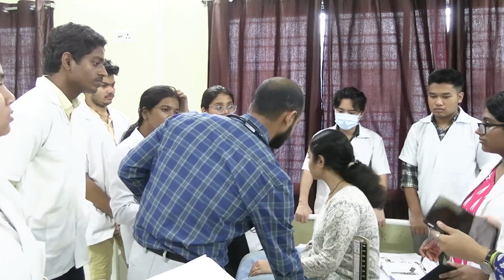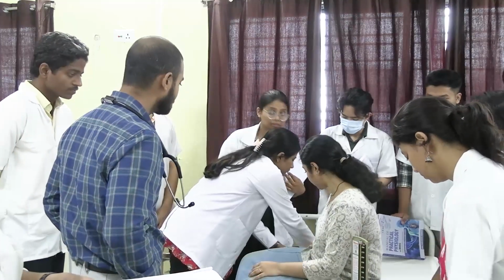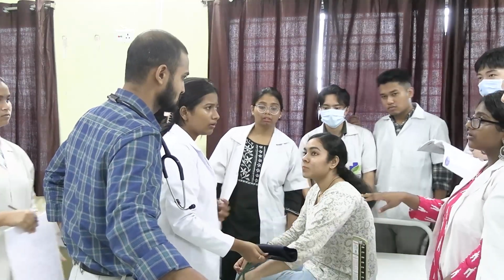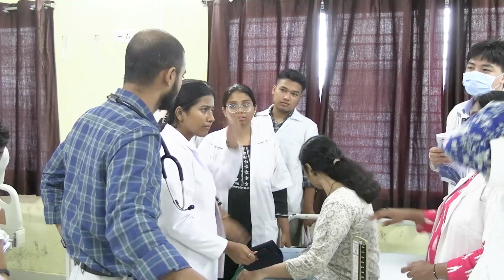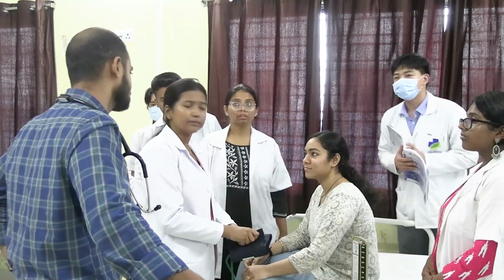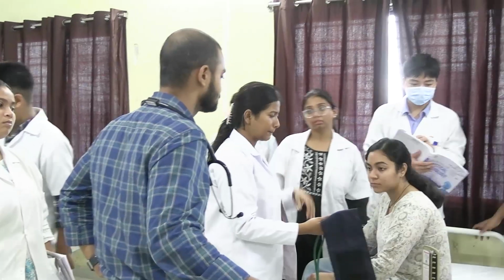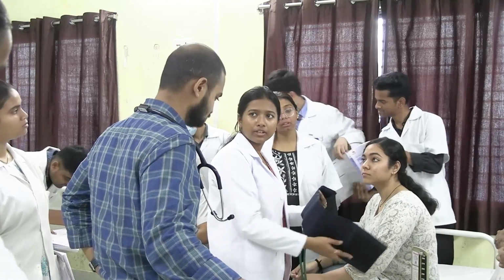You come this side. Do you want to try? Describe and then do the procedure. First, what will you do? First, I have to place the cuff on her hand. No, before that, make sure the patient has rested for 5 minutes. If she has taken some medications, or is anxious, or has taken coffee, caffeine, you have to ask the patient. In that case you will have to relax her for at least 30 minutes. After that, you have to place the cuff on her hand.